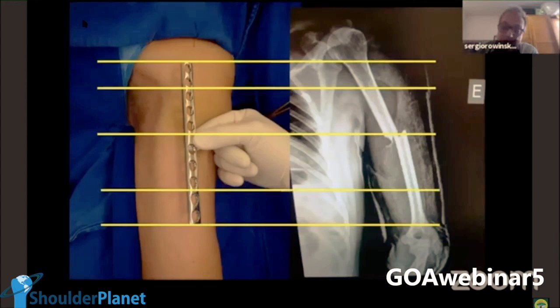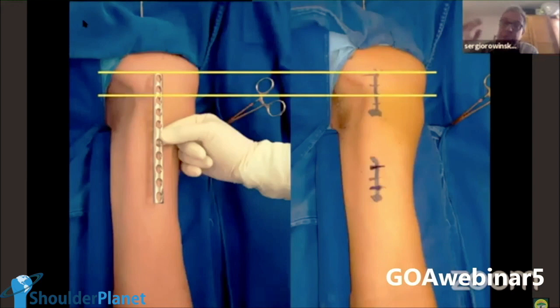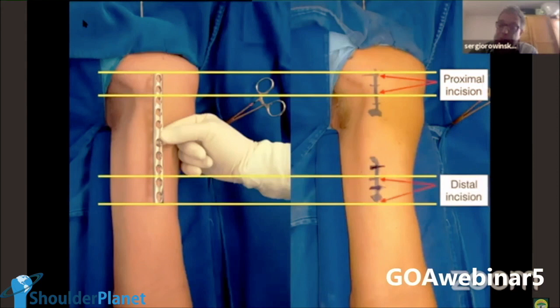And I mark it on the skin, and this is going to be the upper and the lower limit of my incision. So I pass this line, and I pass this line between the second and the third, and this is going to be my incision, okay? I'm going to do the same thing inferiorly, and this is going to be my incision.